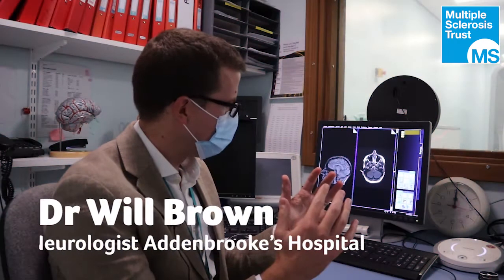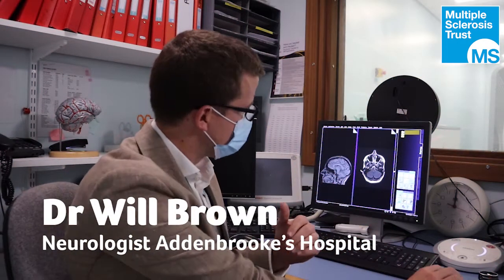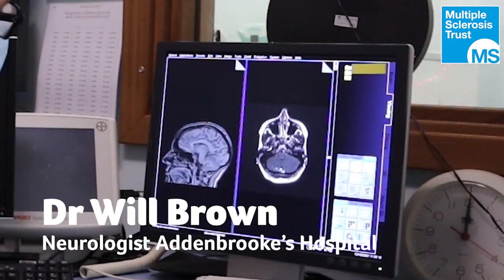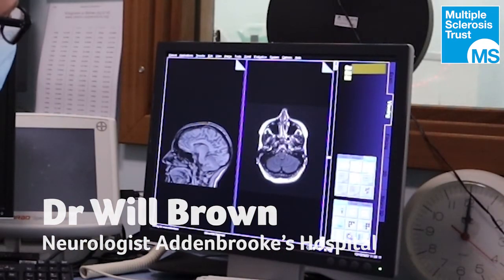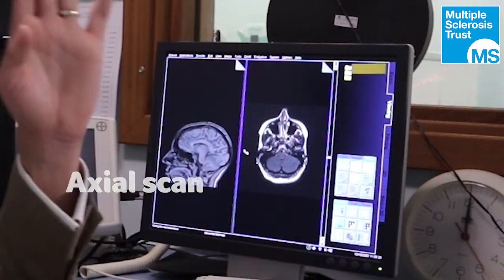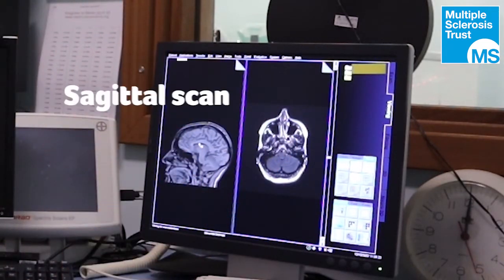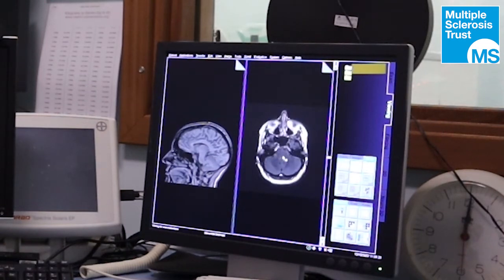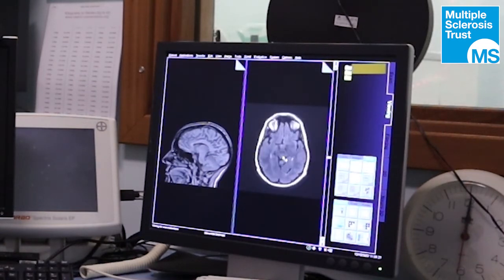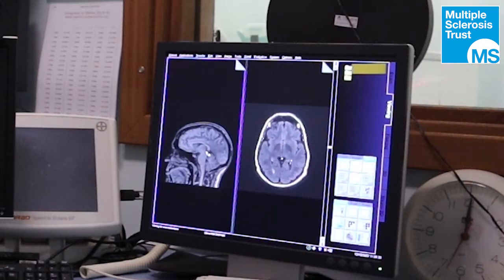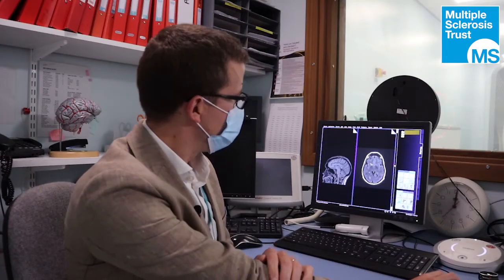The main thing is that we can slice this way, which is called an axial scan, and we can slice this way, which is called a sagittal scan. With each of them we can then go up and down and left to right, so that's kind of what you see on a scan.